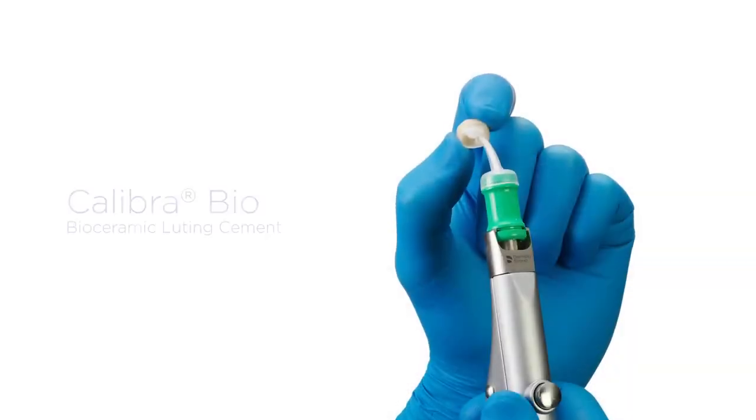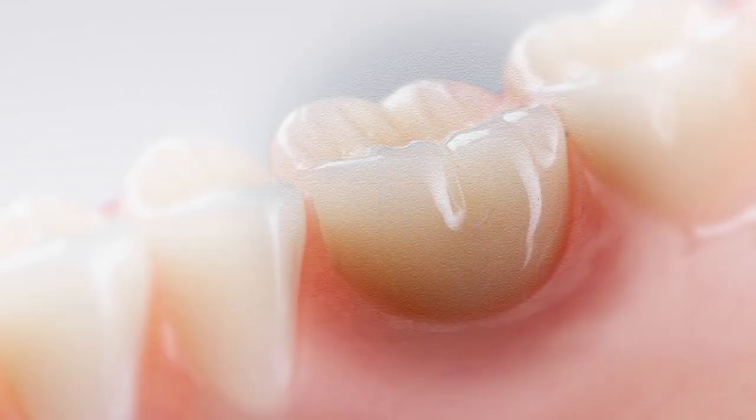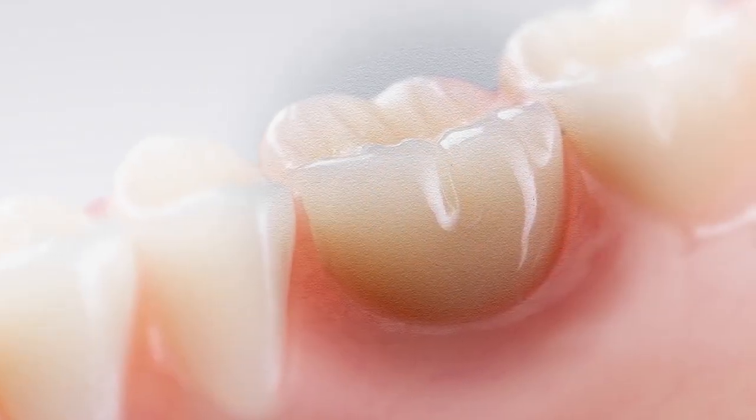Introducing the Bioactive Cement for Improved Marginal Integrity — Calibra Bio Bioactive Cement. The bioactive cement that forms a self-repairing hydroxyapatite layer at the margins to minimize microleakage.